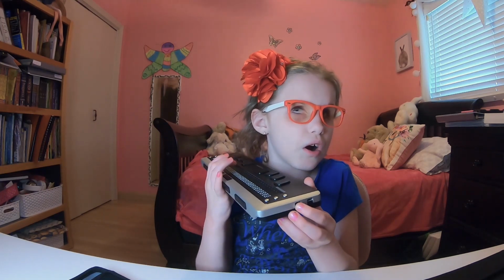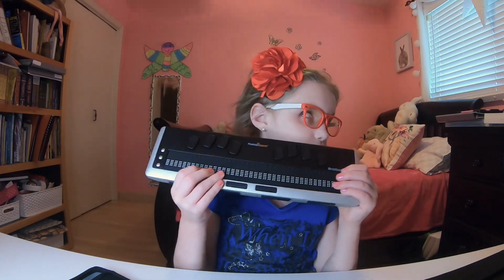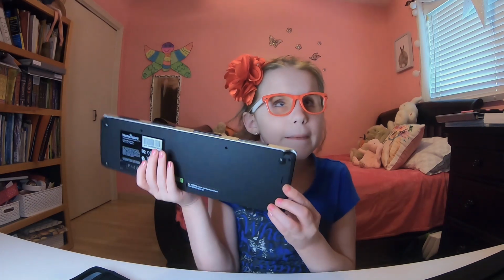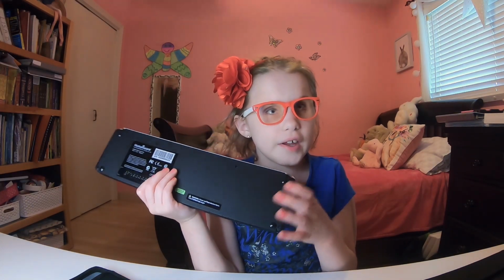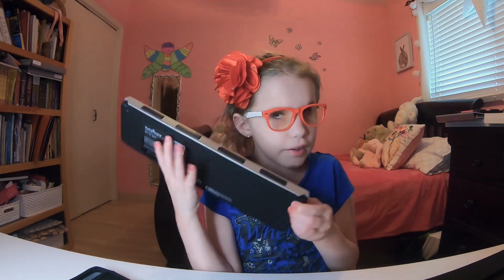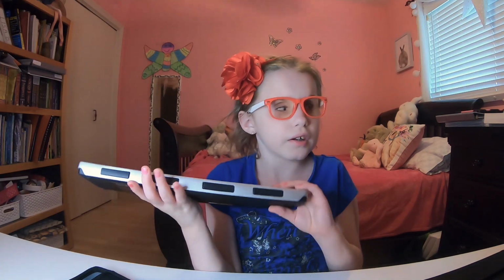You have your power on and off button on the side. It's a small circle with a smaller dot, a raised bump in the middle. You have your 40 cursor routing buttons. There's 40 of them. You have your 40 braille cell braille display. You have your up, down, previous, next thumb buttons, just like the BrailleNote Touch. And you also have little rubber feet to stand your braille display on if you don't want to, because the bottom is really smooth, and if you set it down on the desk and you're trying to type and you're going all out typing, but your braille display is sliding around like crazy, you don't want that. So those can help.